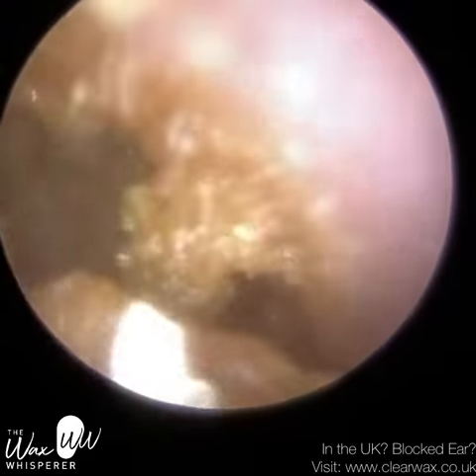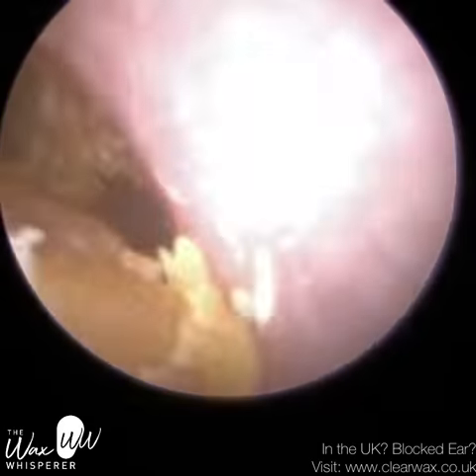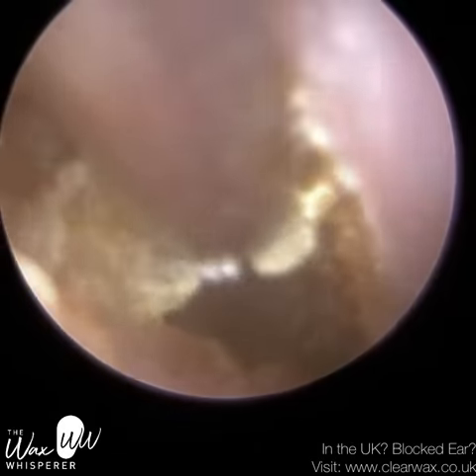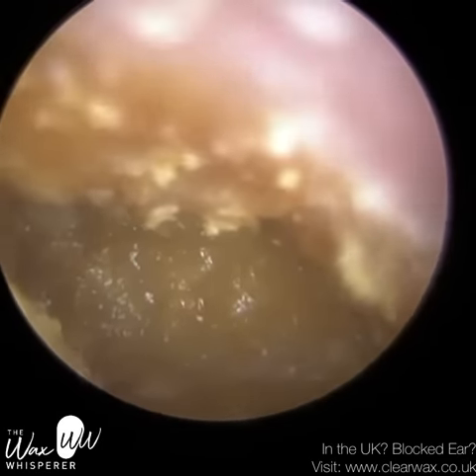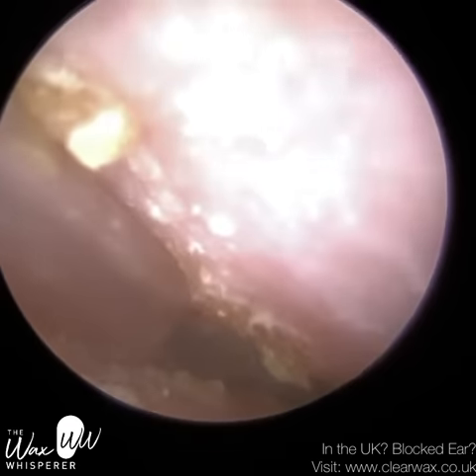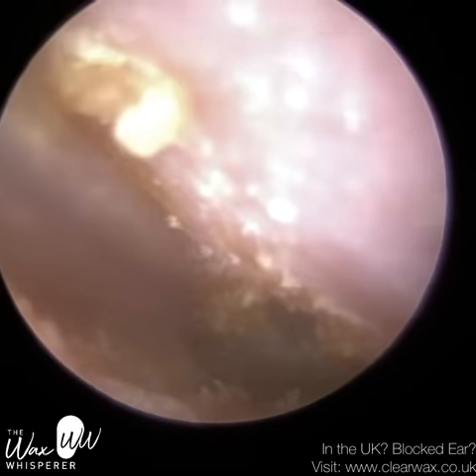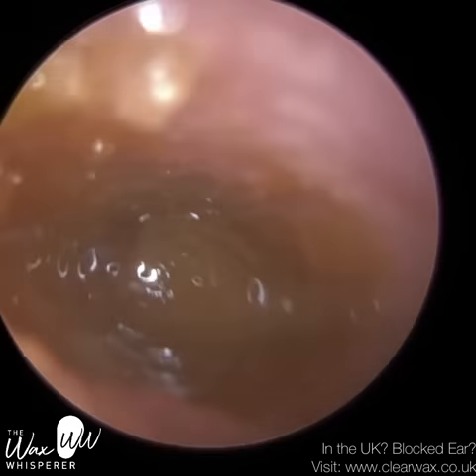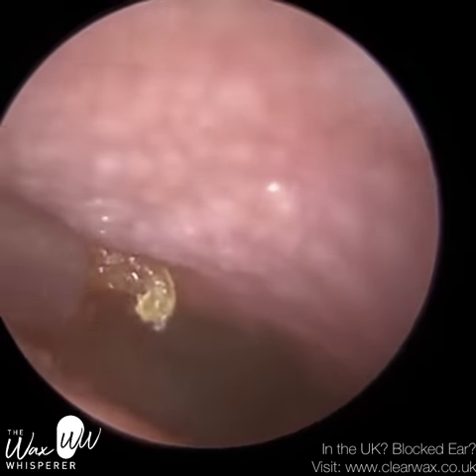This is the patient's right ear, and you can see this ear is a lot more narrow. It's not as wet and discharge-y as the patient's left ear. I initially used a full-size zone on the suction probe but it just wasn't going to go in the ear — the ear was collapsing straight away, so I reverted back to the fine end. This is really blocked beyond the swelling. As soon as I go in with the sucker, the canal is collapsing — all the fluid, all the edema within the cells of the ear canal, which is causing the swelling, is getting attracted by the vacuum.